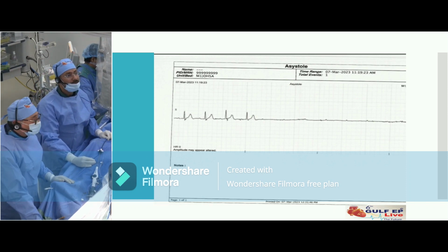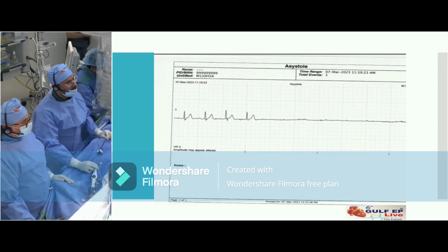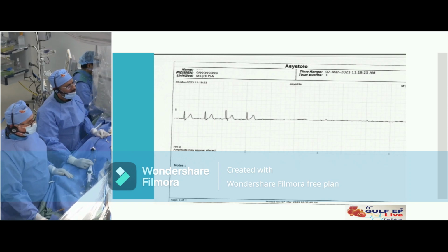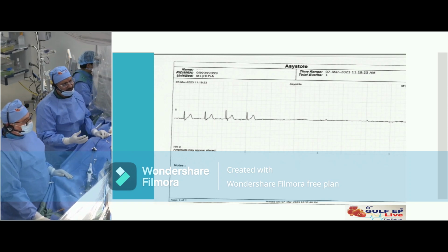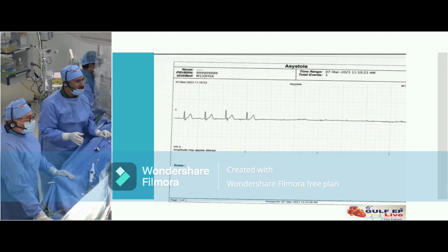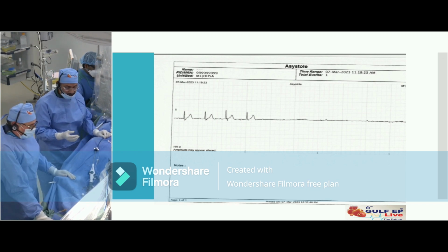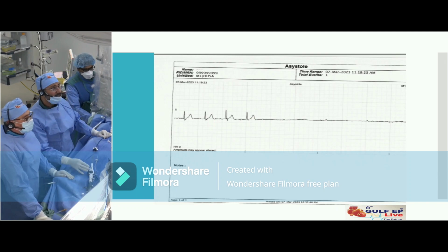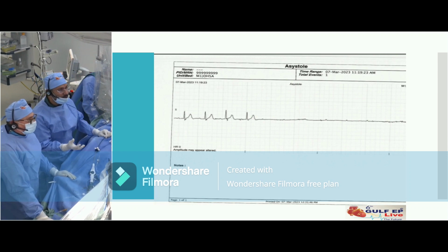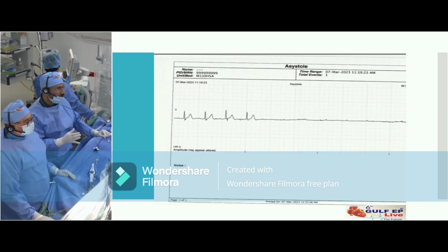The panel is agreeing with you, but I think Hikmet is asking, because he's an older gentleman, are you concerned about the higher incidence of perforation with leadless pacemaker? We're concerned about the incidence. I will not say higher incidence. I will be concerned about the incidence of perforation with any procedure I'm doing, because even with a pacemaker, you have to be concerned about the possibility of perforation. But the issue is that we have to be meticulous in the case. So we need to look at different views to make sure that we are facing the septum in order to avoid such complication.